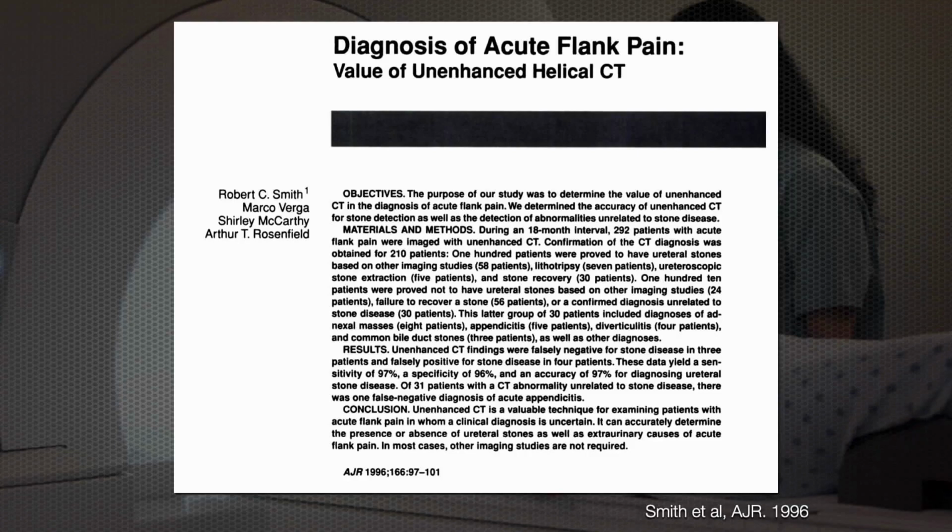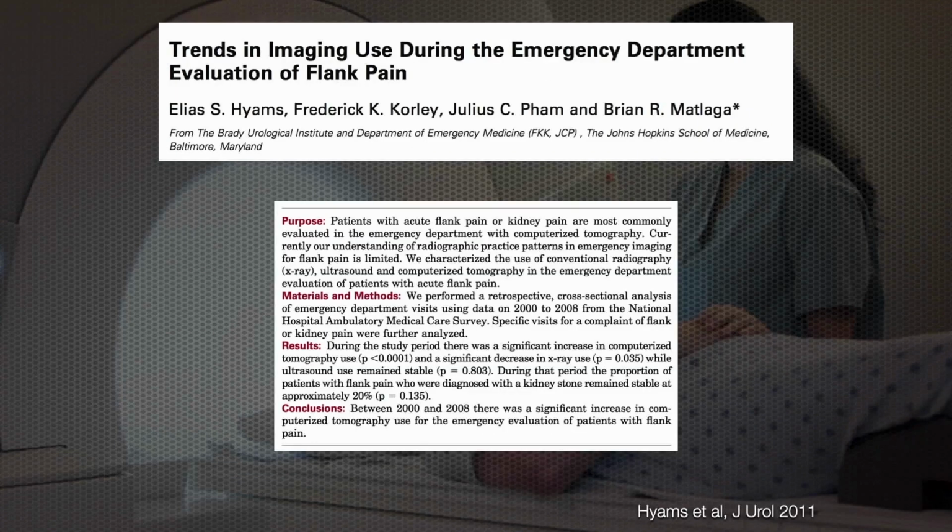Like, say, hey, I've got this patient I'm concerned has a renal stone. Let's scan them. I see the stone. Man, this thing's super duper accurate. And so it helps if you really want that diagnostic specificity, okay? And it's a great test from that perspective.